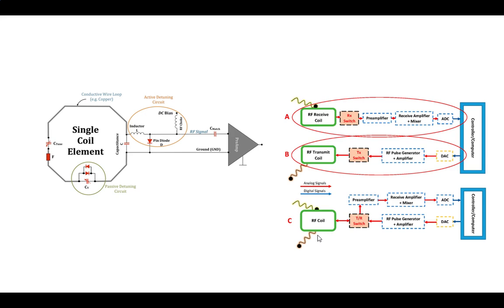Okay, good. What you see on the other side is the two different ways you can set them up. This is the more preferred way, because you can get a more tuned receiver and transmitter. But you can do them together for simplicity, and it has fewer coils. Basically, the receive coil comes in, there's an RX switch, and that RX switch would also drive your detuning.